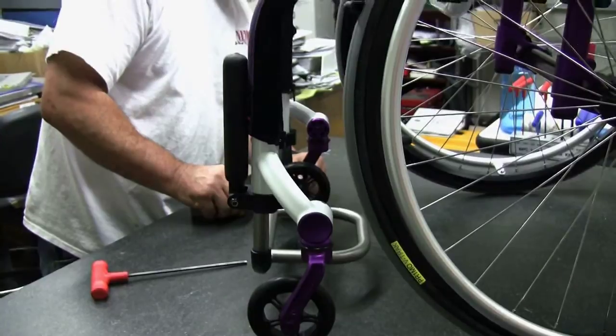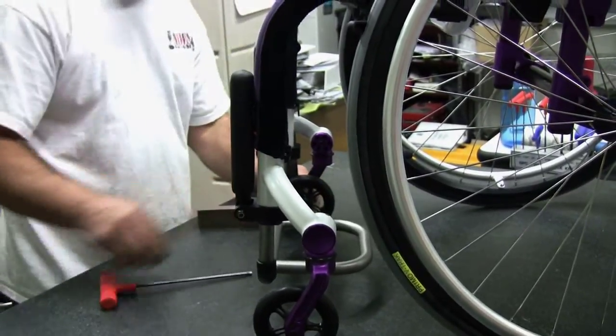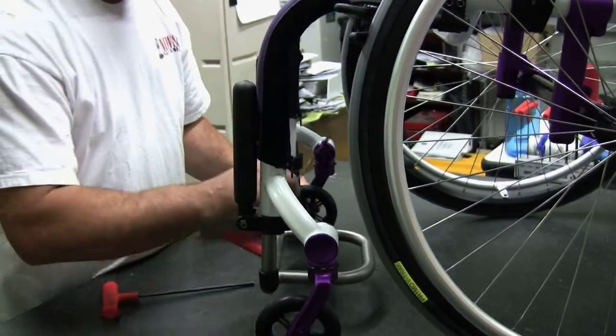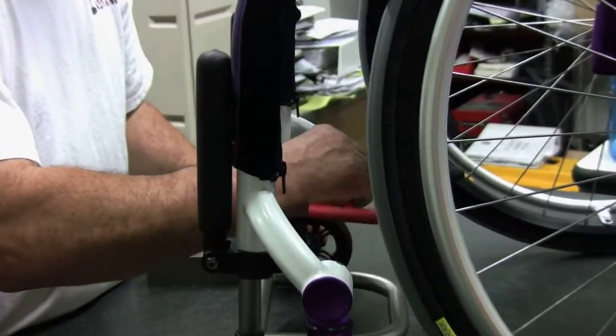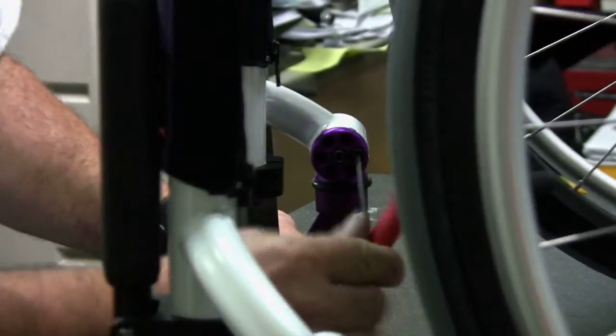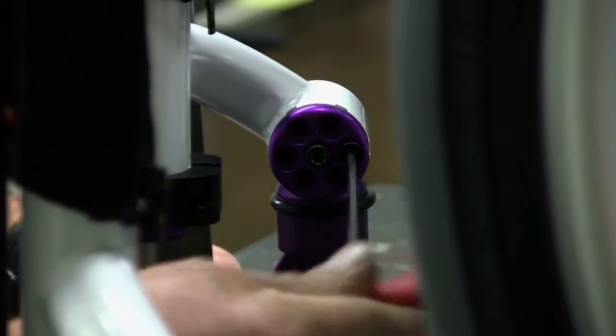Step 5: While holding the fork in place and with the end cap tabs engaged in the tab slots, check to see if one of the 6 perimeter holes in the caster end cap aligns with one of the 3 threaded holes in the caster mount. If so, proceed to step 7.